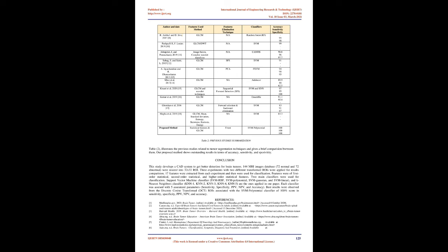Classification. After implementing feature extraction and selecting the best performing ones, we began the classification, which contains two phases. In the learning phase, the data clearly represents the nature of ROIs and teaches the classifier whether it's normal or abnormal. During the test phase, the classifier works based on the previously taught instruction. We have used two types of classifiers as shown in the table below. In this step, the data is classified into two classes of brain images, normal and abnormal images.